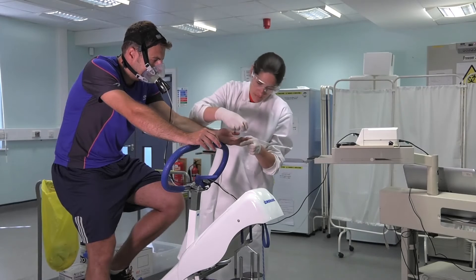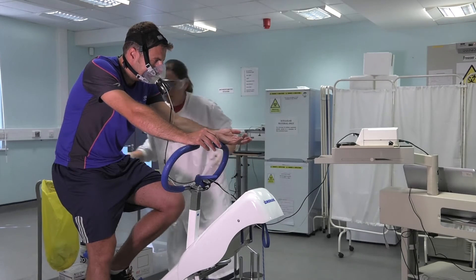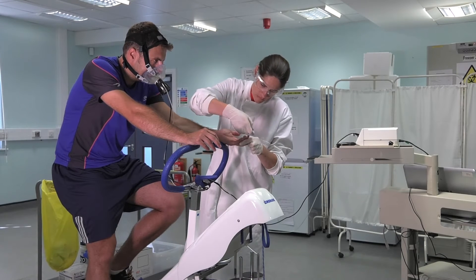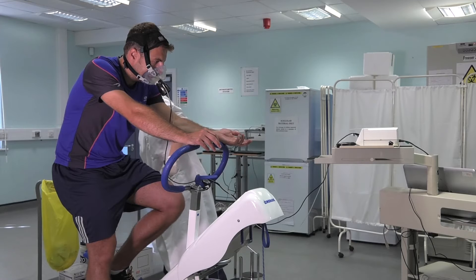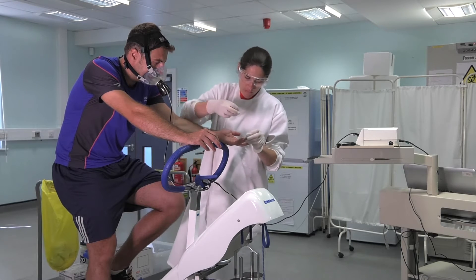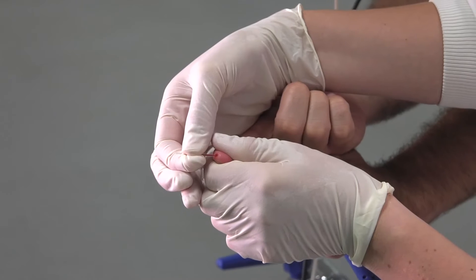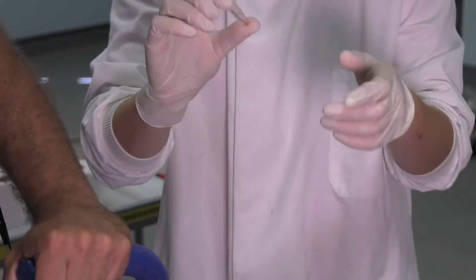Once this is done, you can take one more blood lactate sample as your post-warm-up sample. Same procedure as before — use the alcohol wipe, prick the finger, take a blob of blood, wipe it away, and then collect your blood in the glass tube. Remember to try and keep the tube slightly angled down for gravity to help it go up the tube.